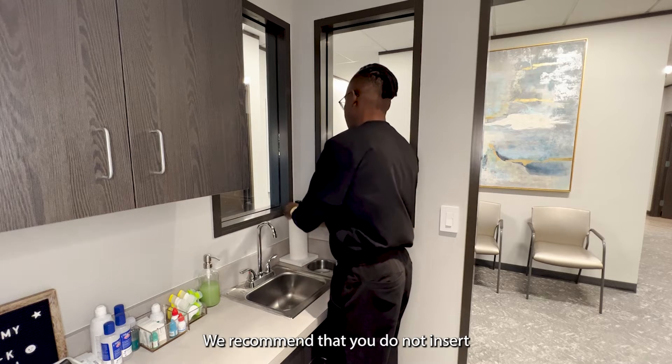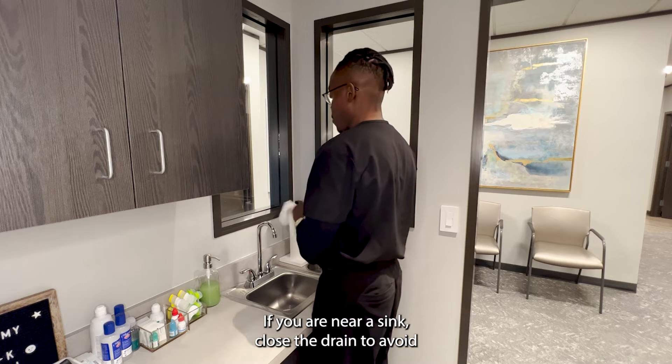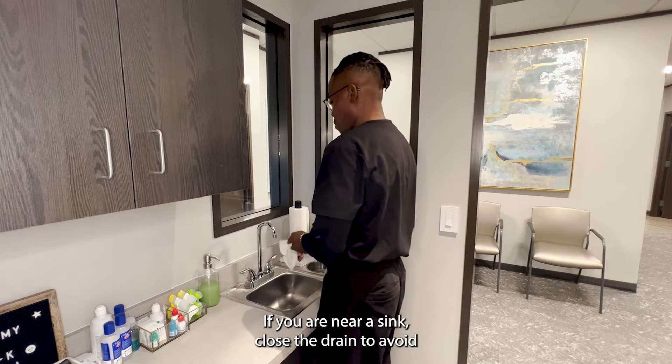We recommend that you do not insert and remove your contact lenses directly over a sink. If you are near a sink, close the drain to avoid a lost contact lens.